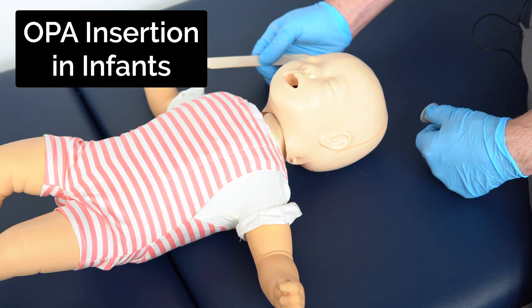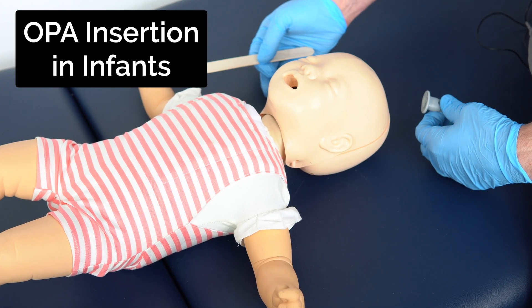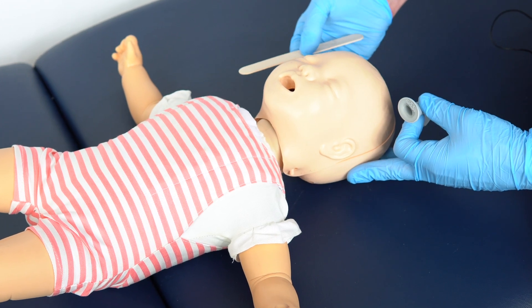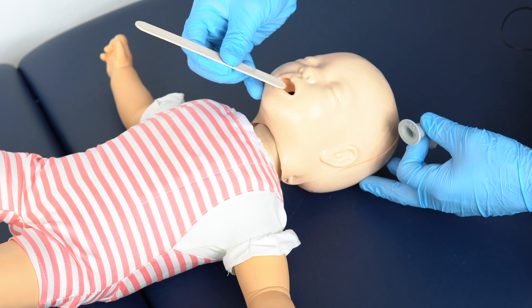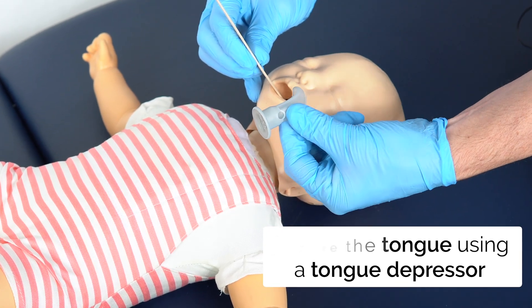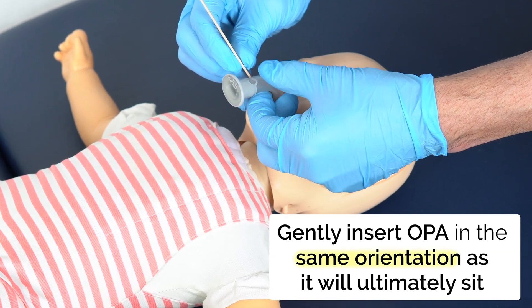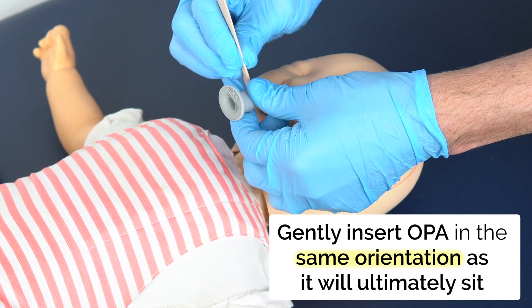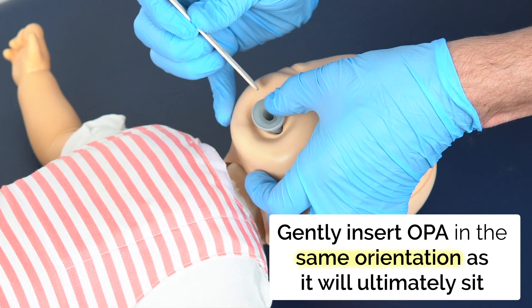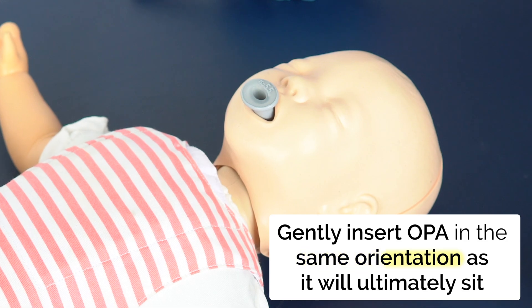In an infant, because they have different airway anatomy, it's important to demonstrate how we put the oropharyngeal airway in in a slightly different manner. With the head in the neutral position, I'm going to use a tongue depressor just to gently press the tongue down, and then insert the oropharyngeal airway in the same orientation that it's going to end up — so different from how we put it in adults — gently pushing directly down, removing the tongue depressor, and it will sit in the same way as adults.